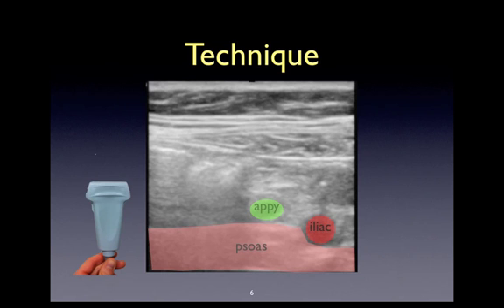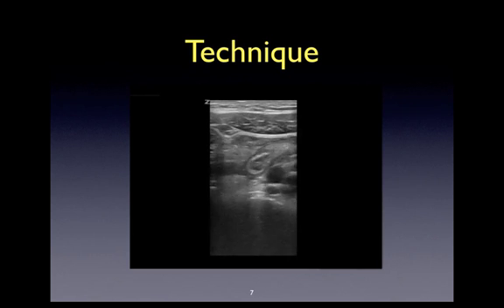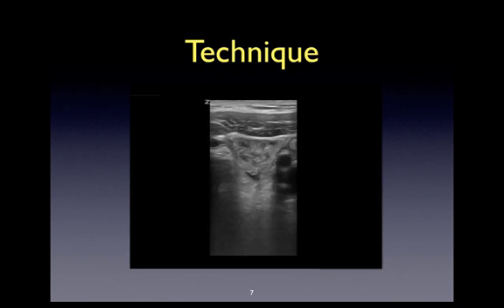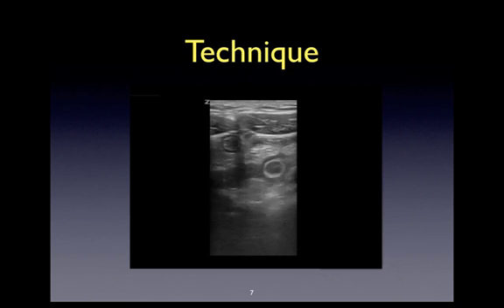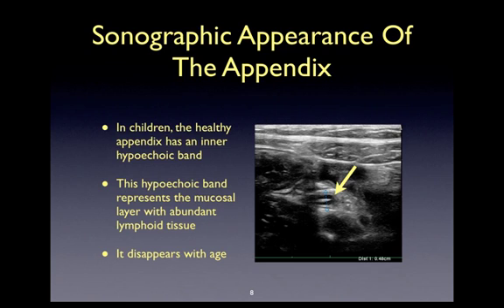Here is a beautiful example of appendicitis. Note the targetoid appearance that the appendix will take in cross-section. Visualizing the appendix can be challenging, since the structure can easily be lost within the contents of the right lower quadrant.